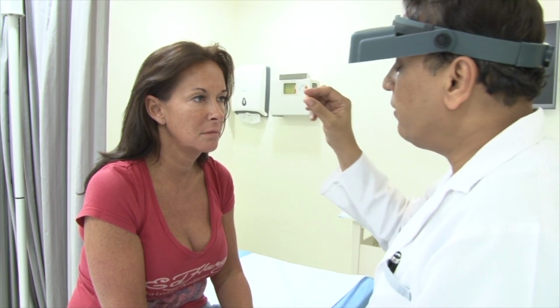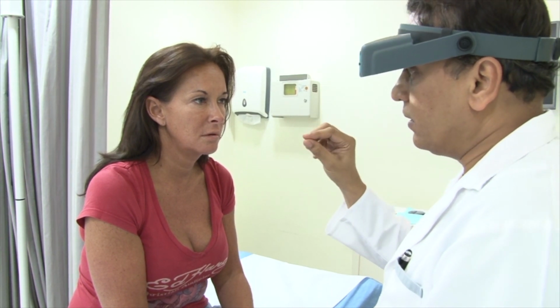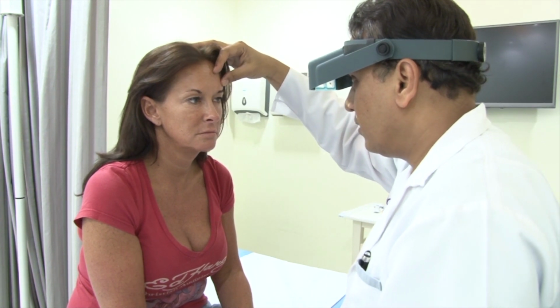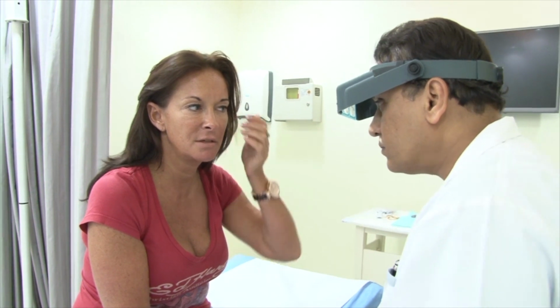Maybe doing very fine, thin fillers in the lines, like a mesotherapy, could help stretch that. But I can't assure you. I can't promise you that it will improve. I've got probably two coming down here as well. Can you see them? Yeah, I see one here. Give me a smile, big smile.